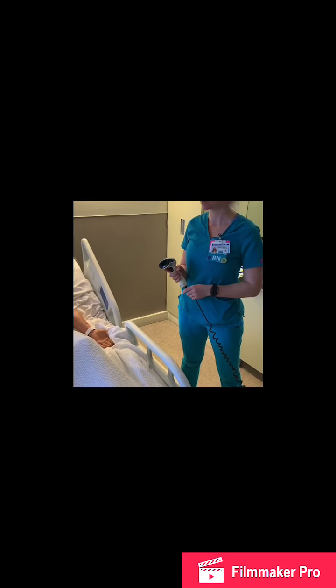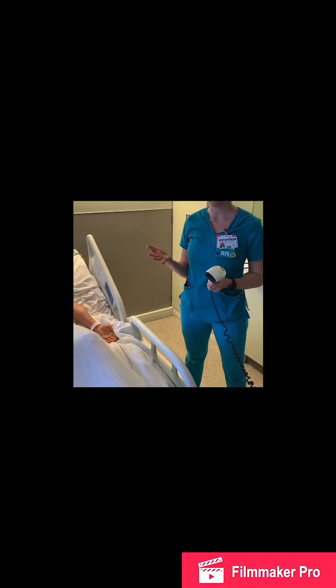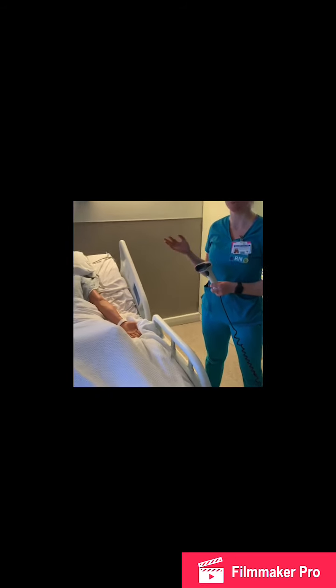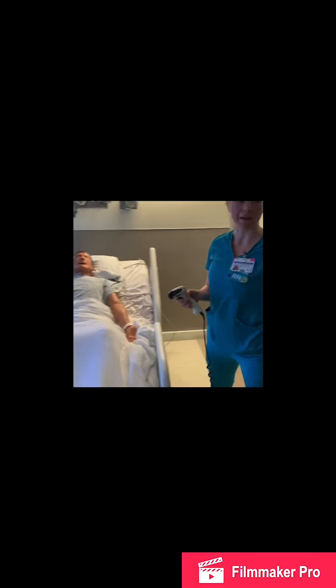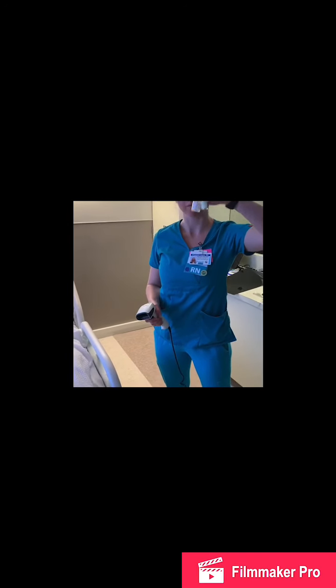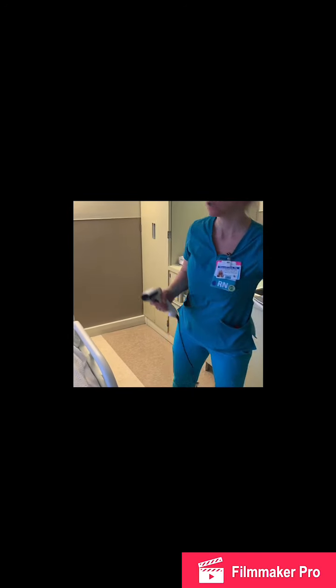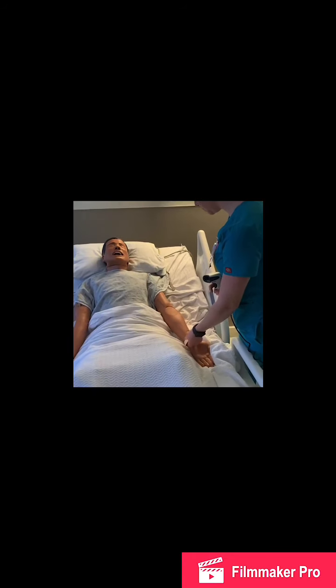This is Mr. Bob, and I'm just going to go through my steps of medication administration. I'm going to identify my patient. I'm going to scan his armband and then scan both of the medication vials that I brought in here from our sterile tray where we reconstituted the medication. Hi, Mr. Bob, how are you doing today? Could you tell me your first and last name, please?